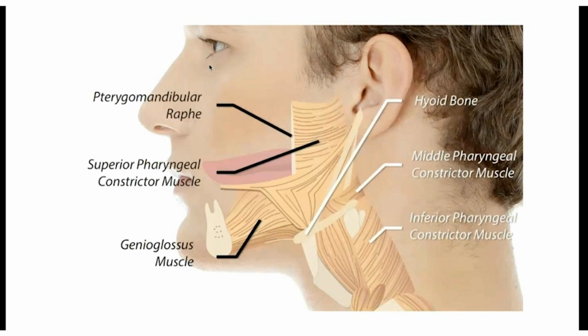Now, I knew appliances worked, but I was able to be part of a drug-induced sleep endoscopy, which is something that patients have to undergo before they are allowed to get the Inspire. I went to one of these, and essentially the patient was put to sleep, and then the video camera was put down the airway to show the collapse and to show what happens when they bring the jaw forward. So I'm going to share that video with you now, because to me, it was so eye-opening.